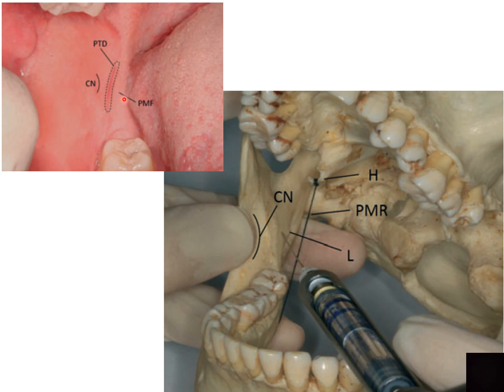And the third one is a depression. This is a depression you would visualize in the soft tissues. It can be ovoid, it can be linear, it can be circular. Sometimes it's very prominent, sometimes less so. But in any case, just lateral to the pterygomandibular raphe, you would identify a depression in the soft tissues, which is known as the pterygotemporal depression. Now, that is the point of your needle penetration with your inferior alveolar nerve block.